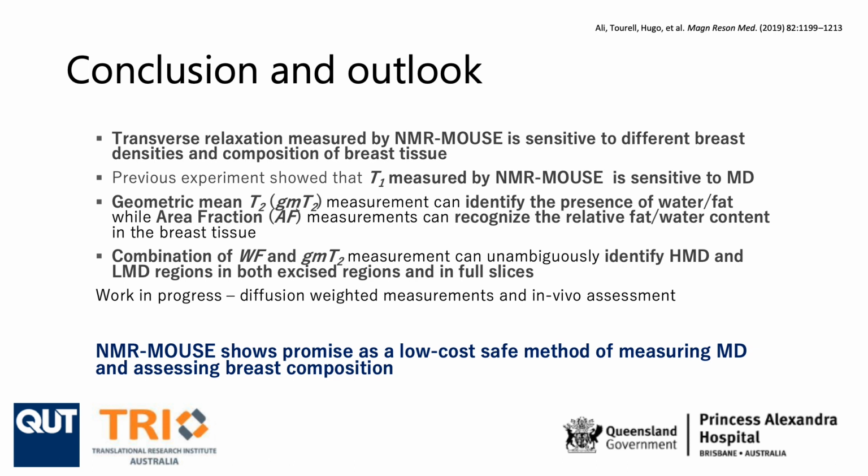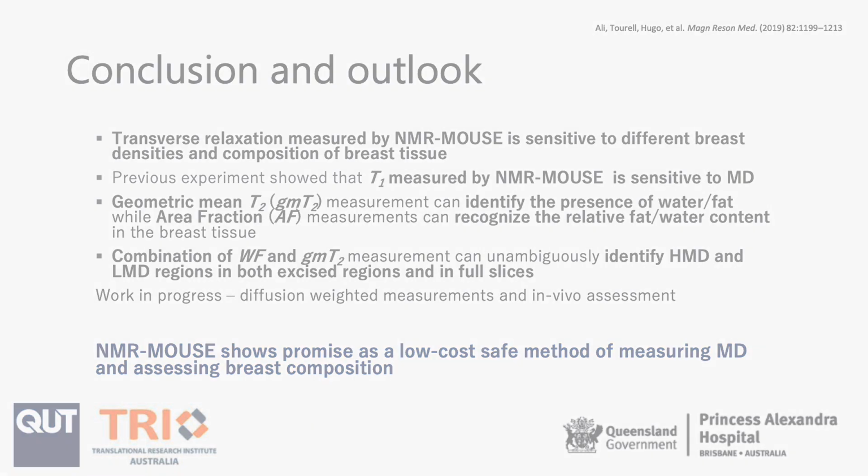Overall, NMR-MOUSE shows promise that it can be an effective platform for mass screening of mammographic density at a relatively cheaper cost and without involving ionizing radiation.